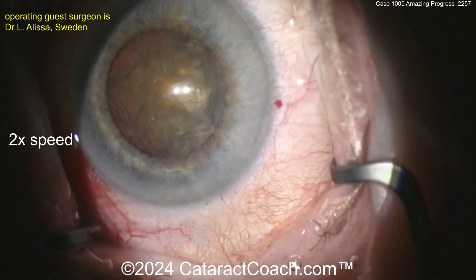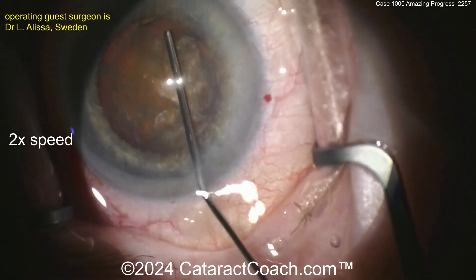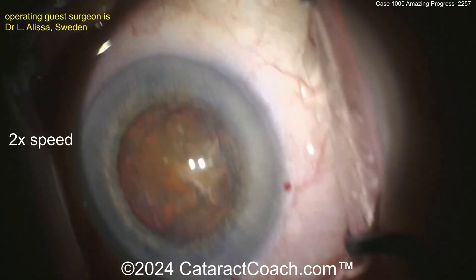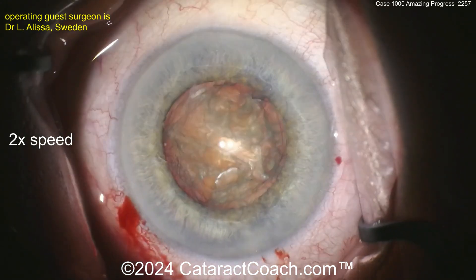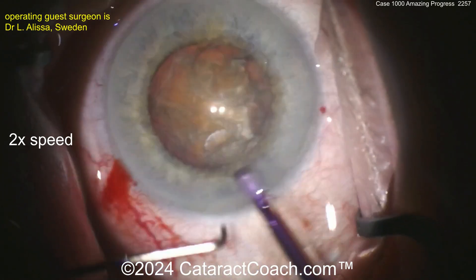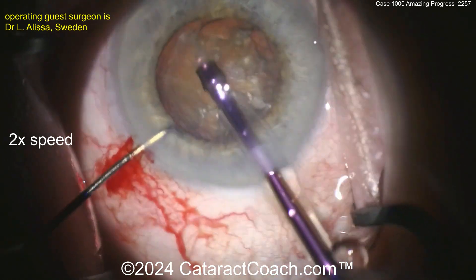It certainly looks like just using coaxial lighting — those two dots of light on the corneal surface — and that's why the periphery looks very dark. The FACO probe is going in. Let's see the position — going bevel up or down. Looks like bevel up.